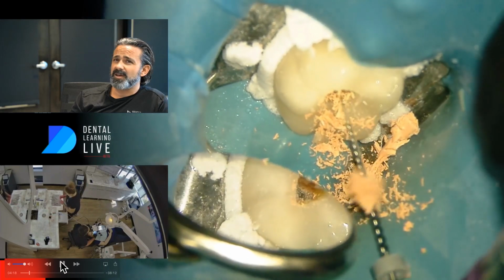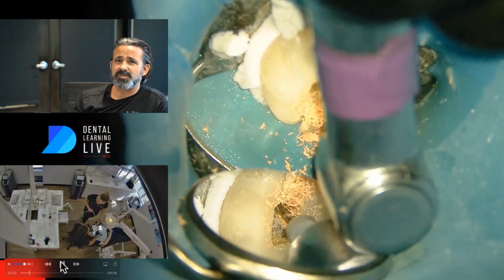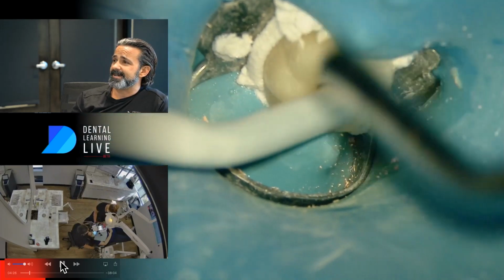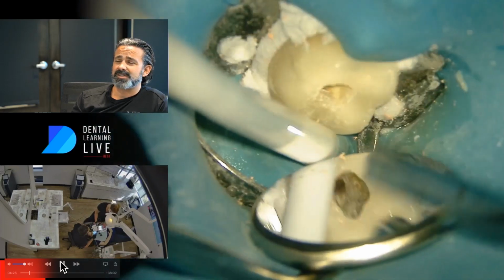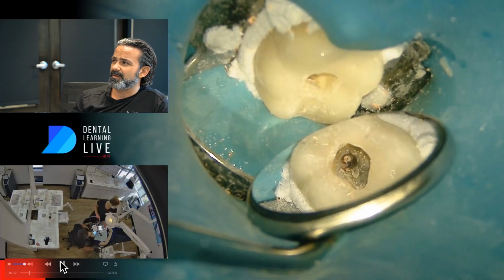And then as I get down into that middle part of the gutta percha, I'm just choosing a smaller retreatment file and seeing where it goes and seeing what that density is like. Now you can take a look in there. I'm making my way down.